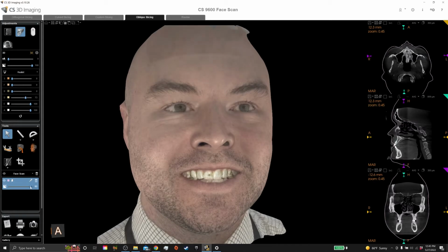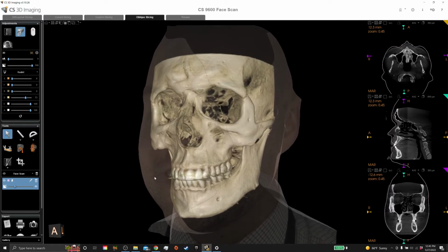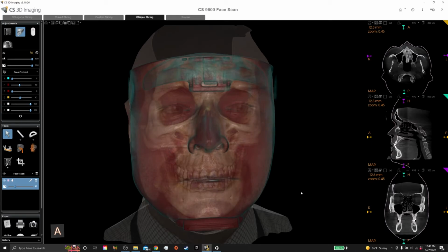Patients will feel like they're a part of the future, and it can interrupt normal patterns that influence decision making, helping to frame information in context that's impactful and in a way that they remember so that it's easier to make decisions based on overall value. Not everyone needs this, but it's helpful to many who experience barriers to decision making when sophisticated information is presented.